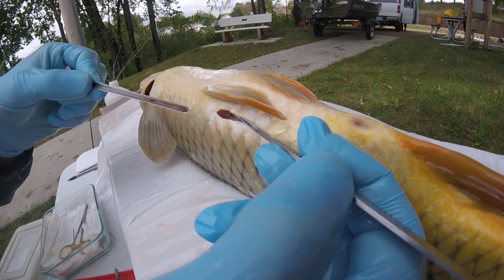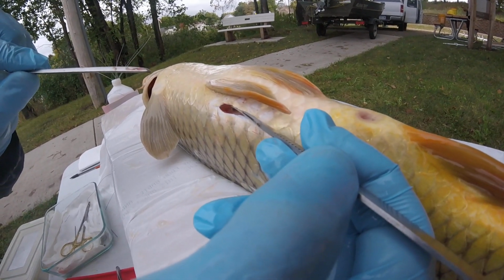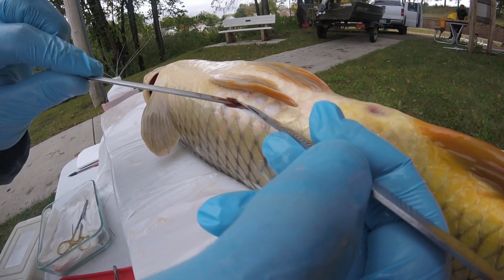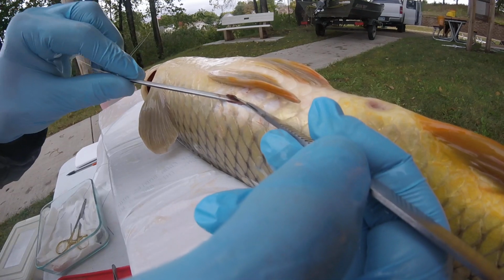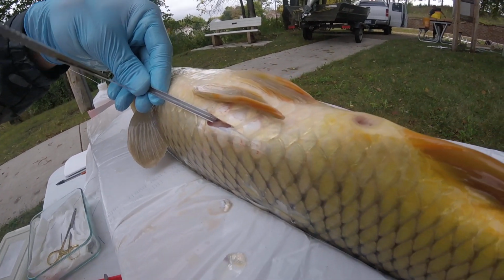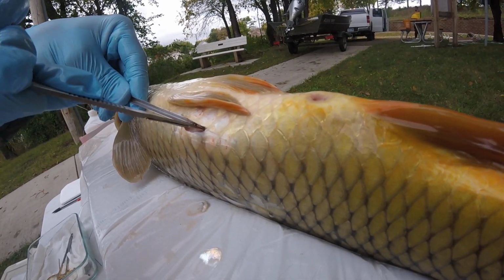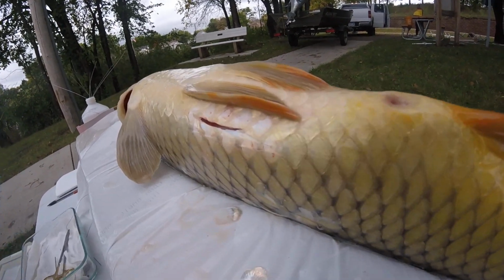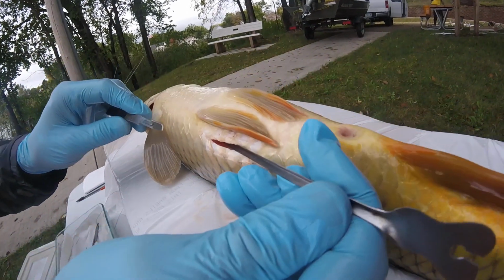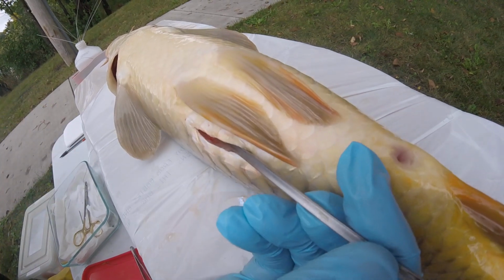And so I'm going to take this guide. What I've done now is just gone in, and we're trying to make sure that I don't puncture the gonads. Okay. Because that causes more stress. So I'm going to go in with this blunt thing that can't cut anything, and that allows me to guide the blade. So I can cut without worrying about hitting those gonads. I see. And then I'm making the incision just wide enough so that I can come back with the tag and fit it in there. So I'm just going to open it like that.